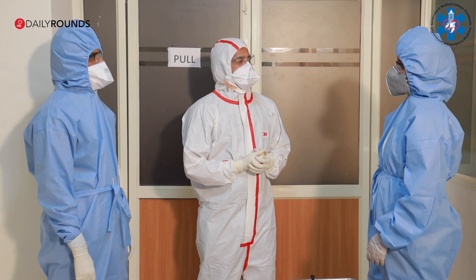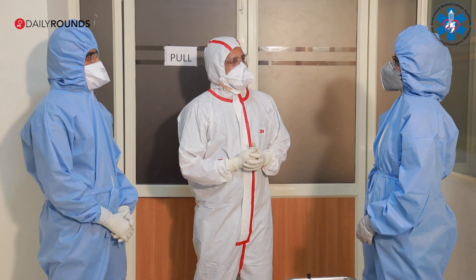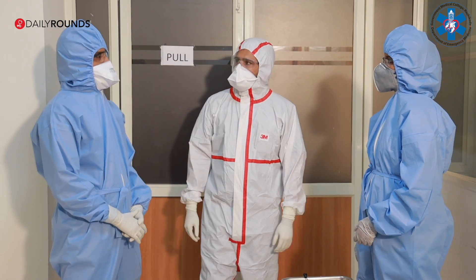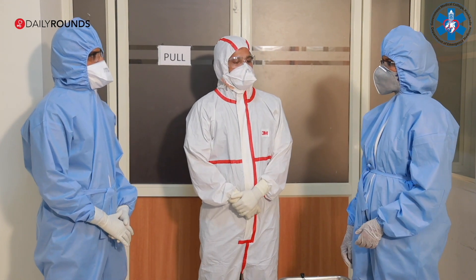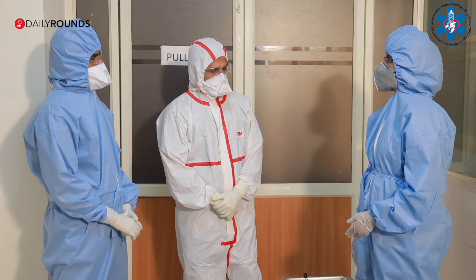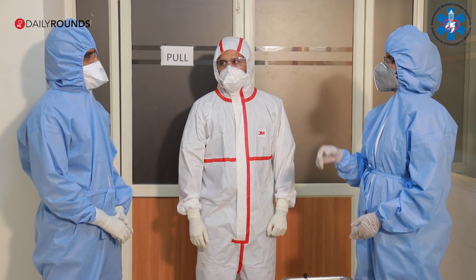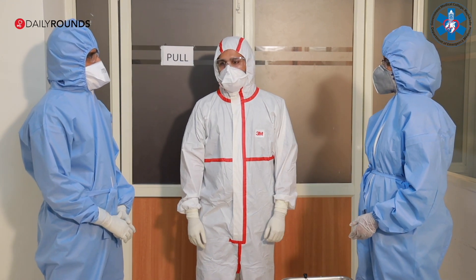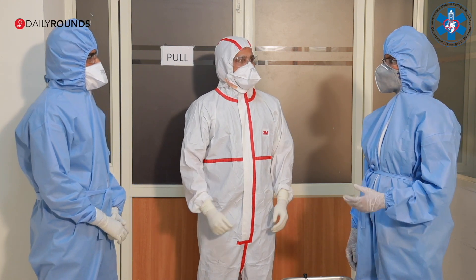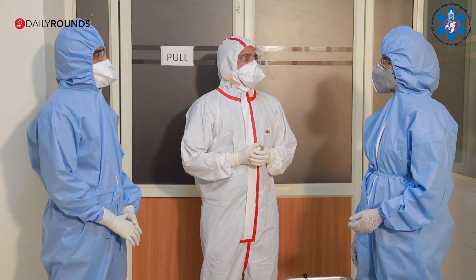The team introduces themselves: Dr. Kavitha as Emergency Physician and team leader, Dr. Asher Tazal and Dr. Agil as emergency physicians. As Dr. Asher is the most senior, he will be the intubator, Dr. Agil will be the airway assistant, and Dr. Kavitha will be the team leader managing drugs and monitoring the patient.